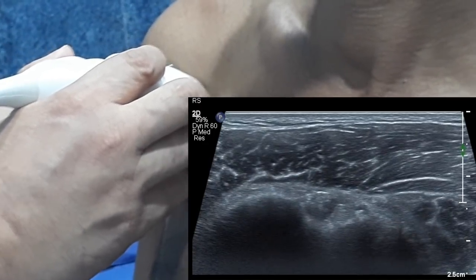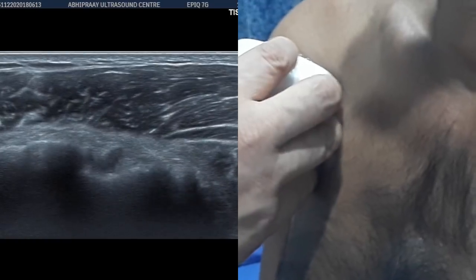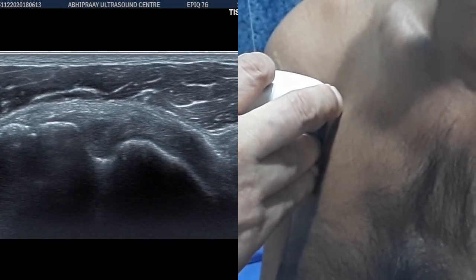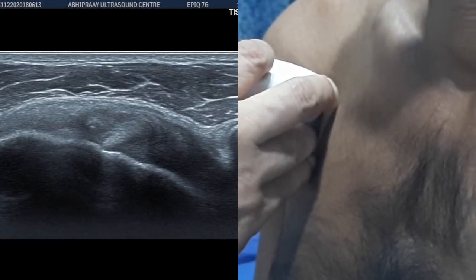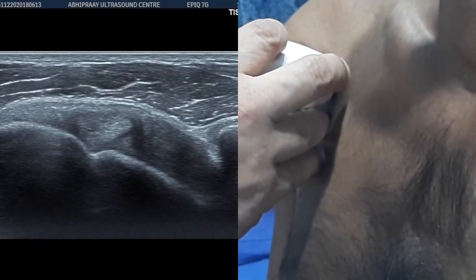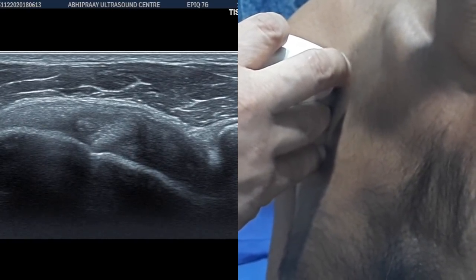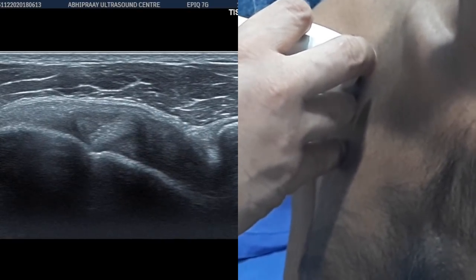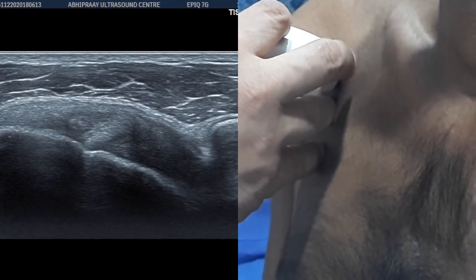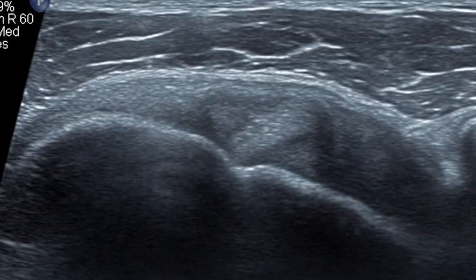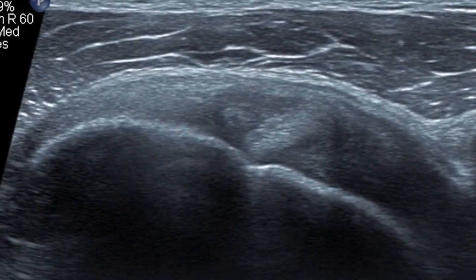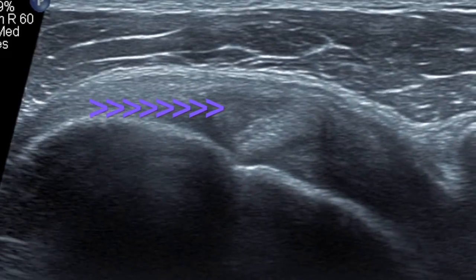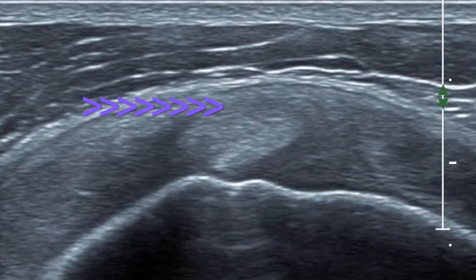If you assess the biceps tendon as it goes in the intra-articular part, that's when the tendon becomes more oblique. You will see a cuff surrounding the tendon. The superior aspect of the cuff is formed by the coracohumeral ligament and the inferior medial aspect is formed by the superior glenohumeral ligament. This is the cuff of the biceps tendon.